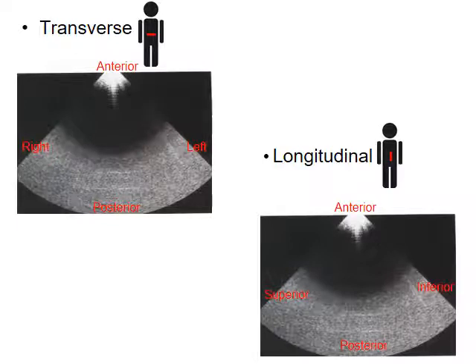And these will often be the images when you're looking at them. You want to look at them and you put your head on the side. And when you put your head on your side, you go, oh yeah, okay, I can make that out now. I can see that. That's these longitudinal images. Just remember that dominant side of the transducer goes towards your patient's head.